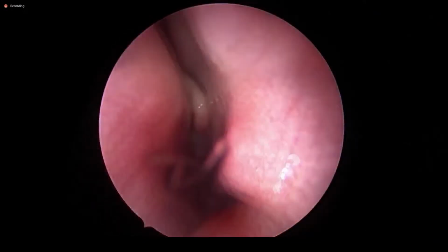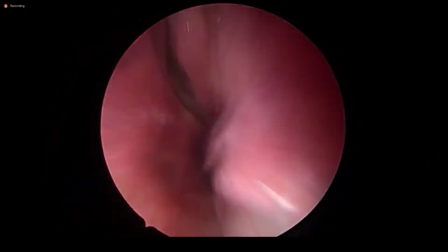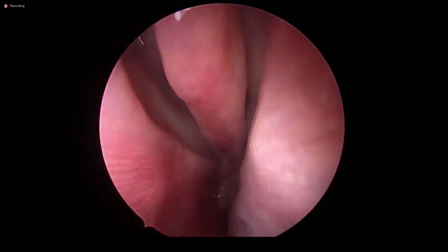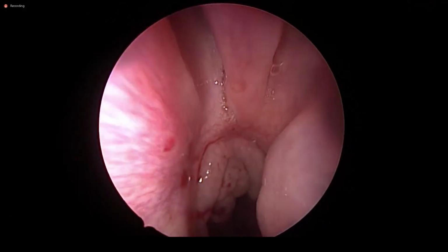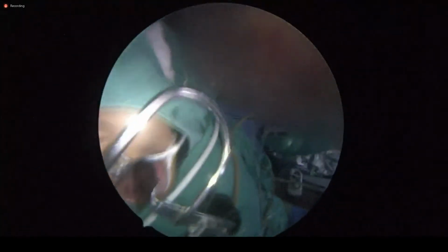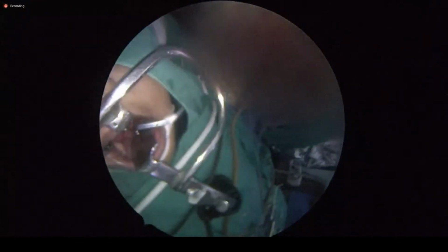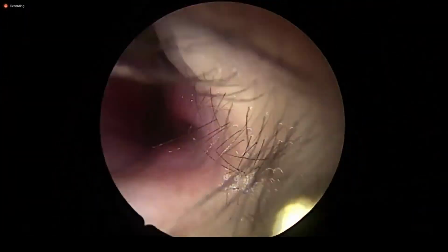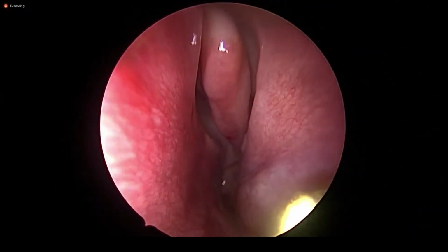So our goal here, the patient presenting with obstruction, is to do a comprehensive adenoidectomy. Our goal is to remove adenoid, not to damage anything else. We have to be careful not to damage the soft palate, the eustachian tube, the pharyngeal muscles behind, and any other structure in the vicinity. Our goal is solely and solely to remove the adenoids.